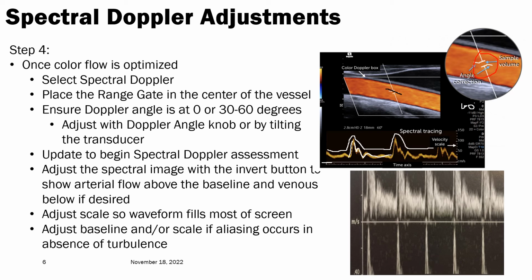If you were to start seeing some reversal here, or a dipping down, where at the end of systole the blood hit baseline, stopped altogether, or the blood was actually reversed, that would indicate that there was significant resistance up ahead. So this shows a nice low resistance waveform.